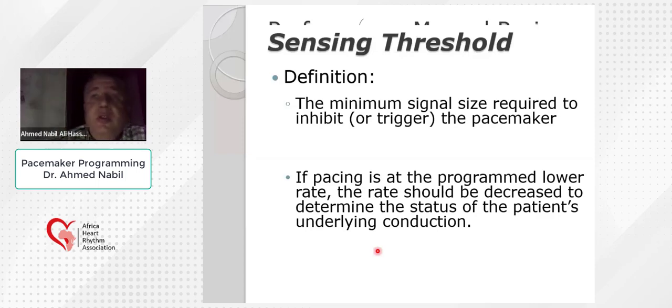We move on to the other function of the pacemaker, which is sensing. Although I need the pacemaker to pace well, I also need the pacemaker to sense well.